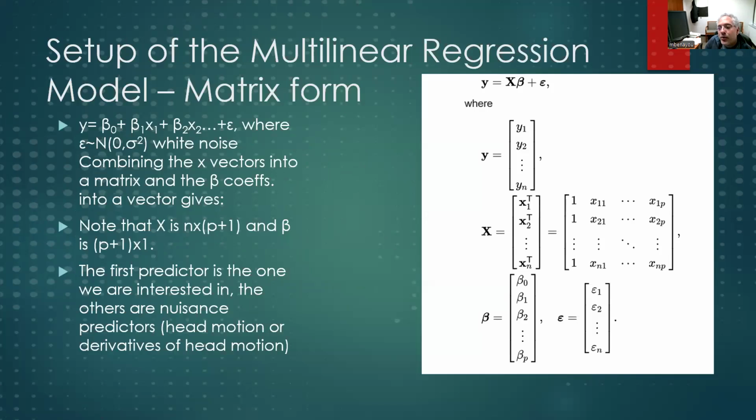So how does that relate to what we do with fMRI? fMRI is a little different. The Y is not a patient's height. It's a measured bold signal. It's a time series. Now, instead of being a single scalar number like 6'4", it's an entire time series of data, the bold signal that we measure in that voxel. That's Y. X, instead of being a single number like the patient's weight that we want to use to predict their height, is the ideal time series that we got when we convolved the hemodynamic response function with the square wave for the task paradigm that governed what the patient was doing in the fMRI experiment.